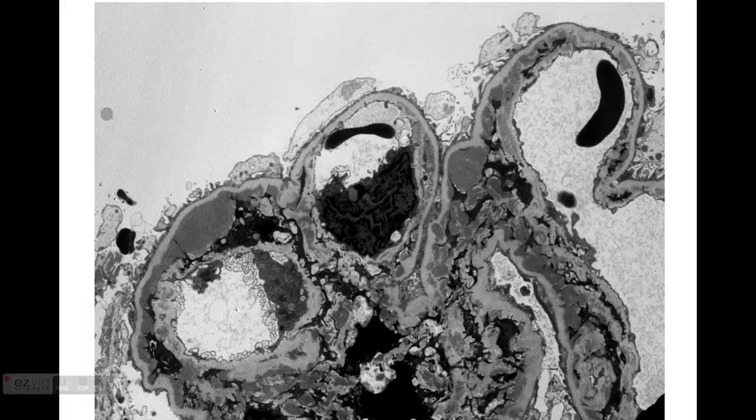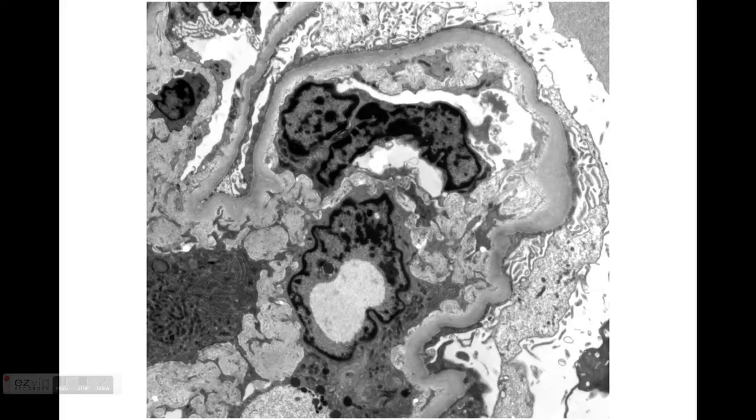However, sometimes you don't actually really have deposits, and you have restructuring or remodeling of the capillary wall without deposition. So here, for example, you have original basal membrane here, and then you have this subendothelial widening, and your endothelium is actually over here, and you have cell interposition and different debris and subendothelial flocculent material deposit in there, but really no electron dense deposits.